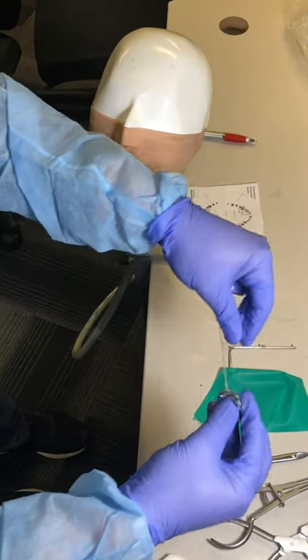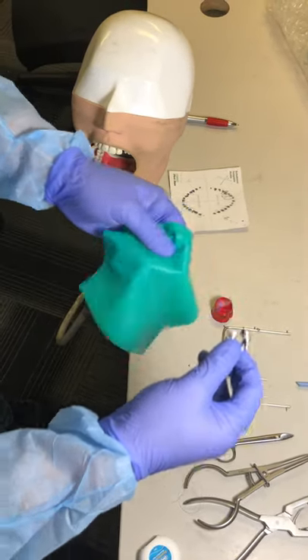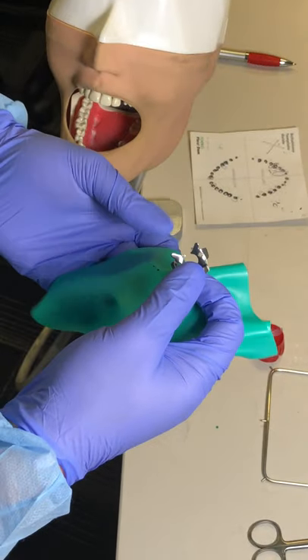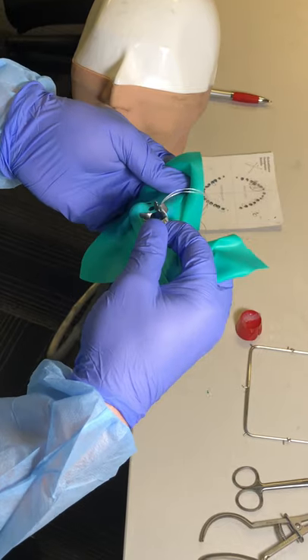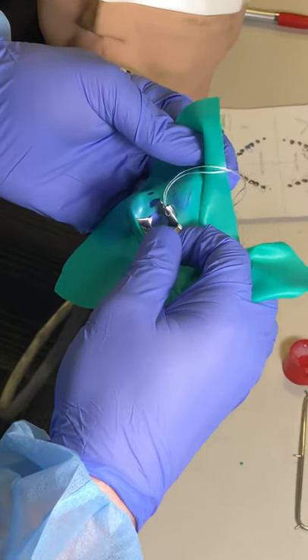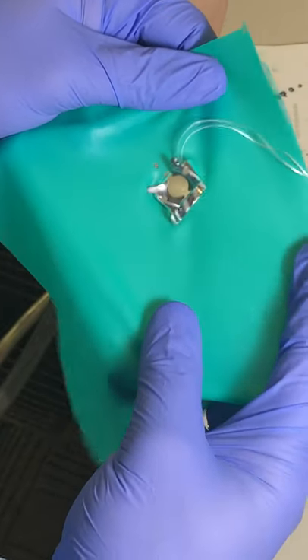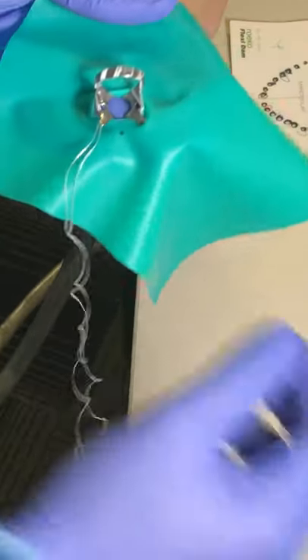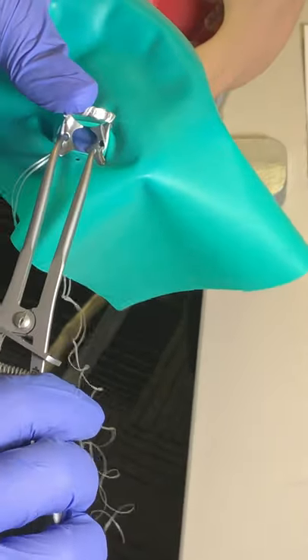This technique is simpler than the one where you place the clamp first and then the sheet over it. Instead, you can do it all together by placing the clamp with two wings inside the first hole of the sheet, adding it all at once — except for the frame. We need to be sure that the two wings are inside the sheet.